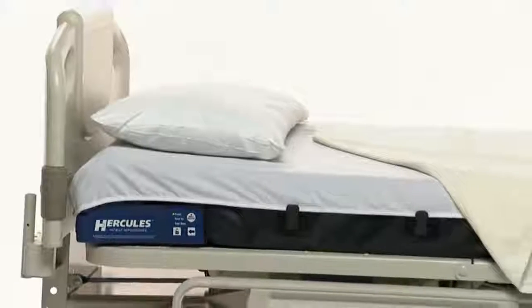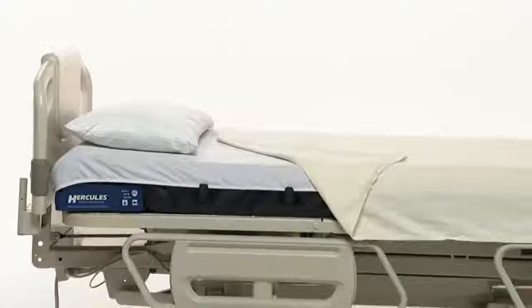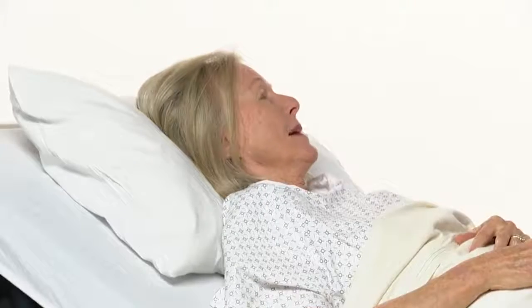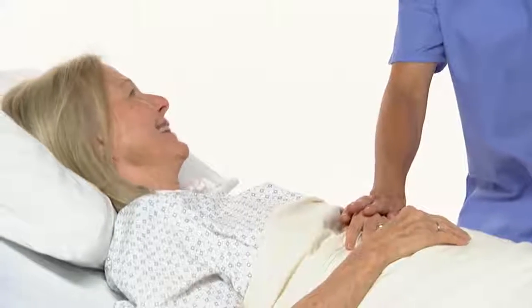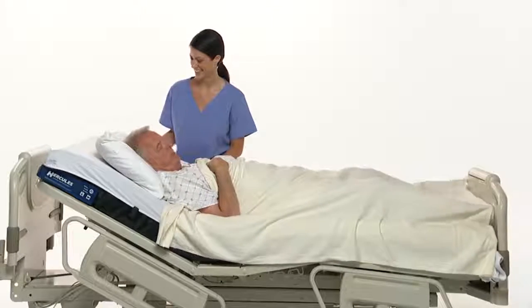The Hercules Patient Repositioner consists of a drive, a sleep surface, and a specialized sheet, and has been designed to reposition patients weighing up to 500 pounds. More important, Hercules protects your patient's dignity by reducing the embarrassment and helpless feeling that patients often experience when multiple caregivers struggle to reposition them.